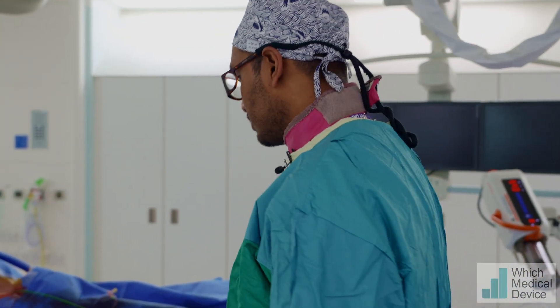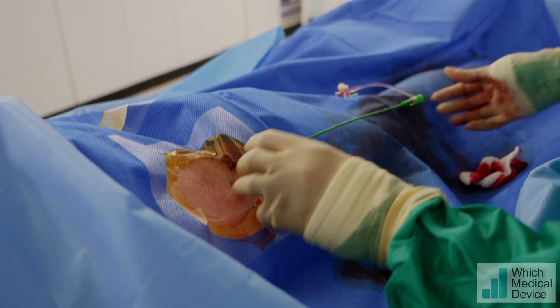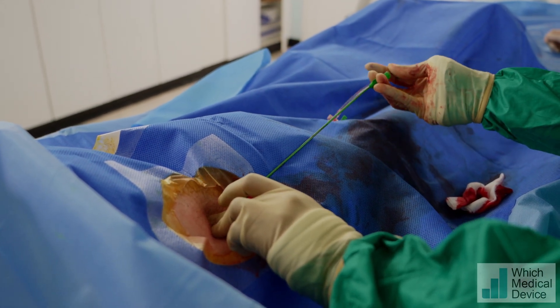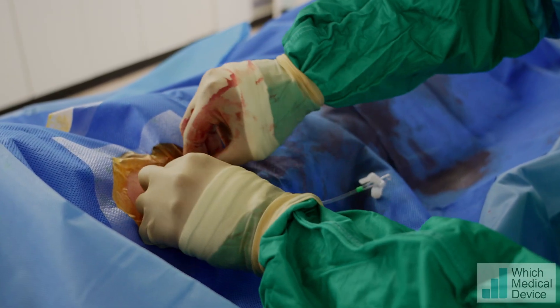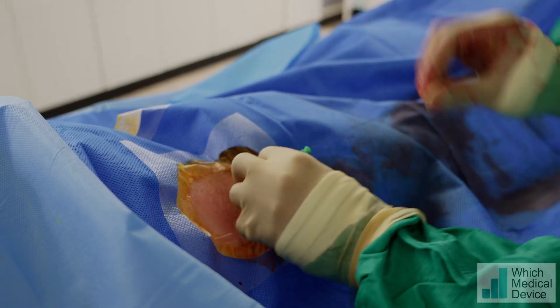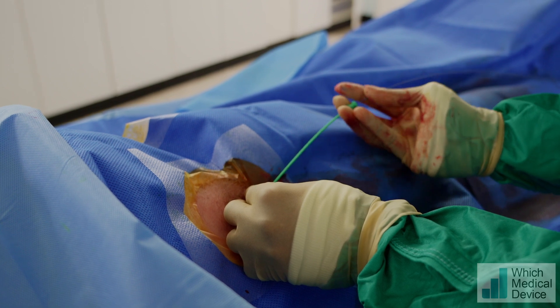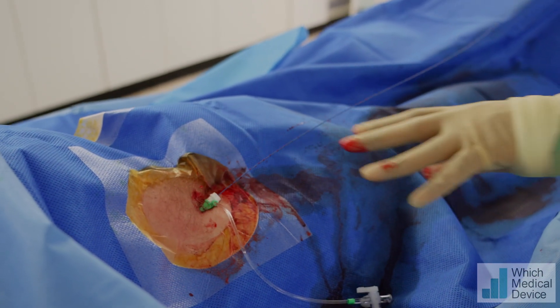So I'm going to go to the patient now. We've got a destination sheath — an Amplatz — in at the moment. I'm going to take this off and swap it for a 6 French short sheath. That's the Cordis short 6 French sheath. You could use any other 6 French sheath as long as it's short — that's the main thing, because you obviously don't want the balloon to open inside the sheath. The tip is quite atraumatic, so that's absolutely fine.